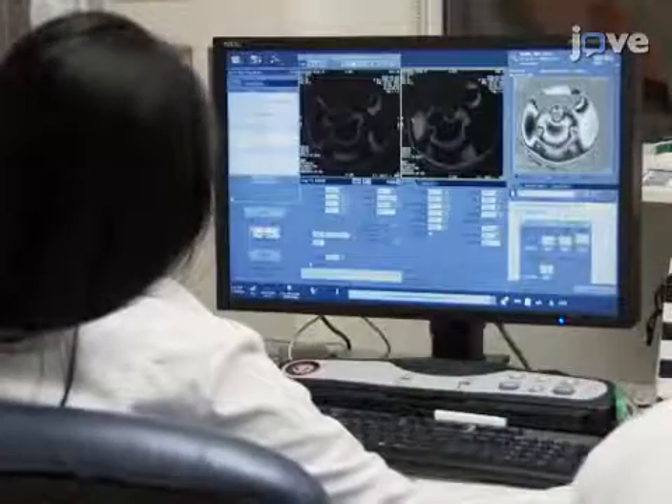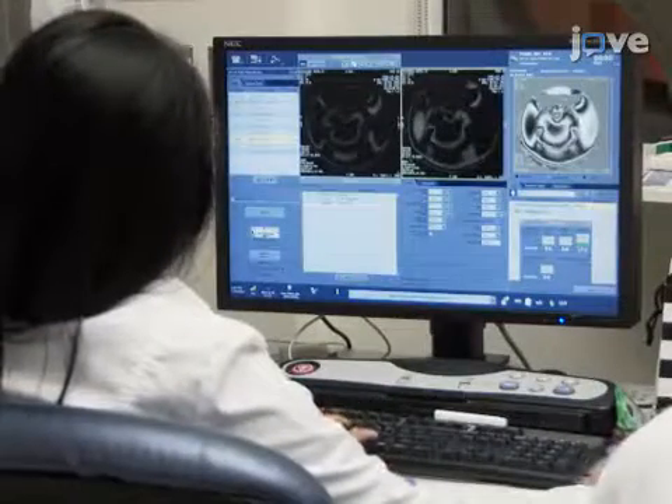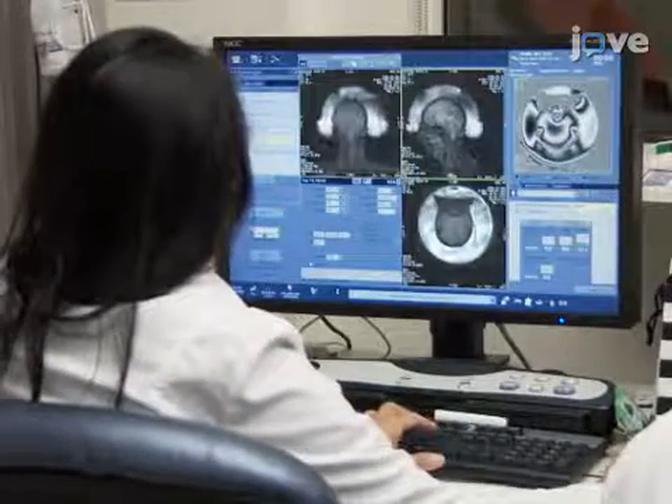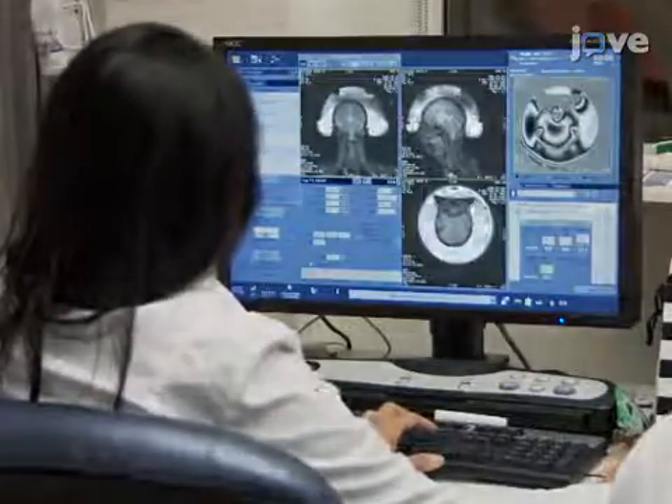Then, after performing a preliminary 3D localizer magnetic resonance scan and a T2 weighted sequence, contour any lesions on the scalp, calcifications in the brain or sinuses.